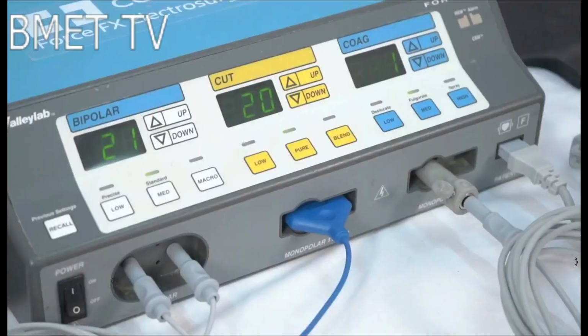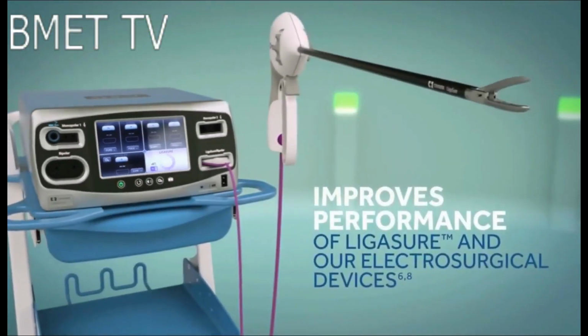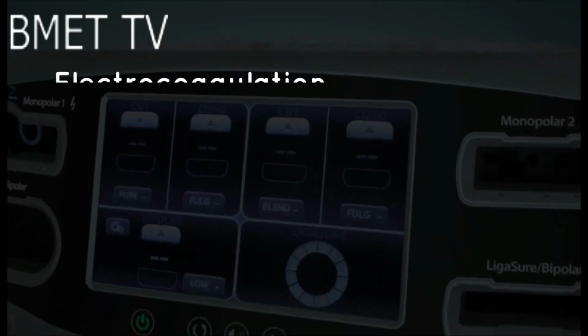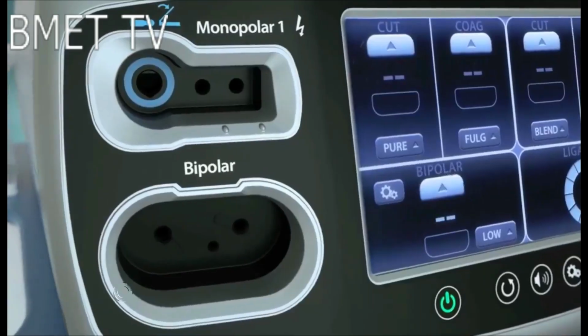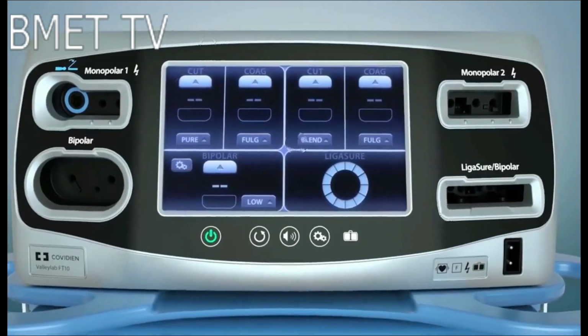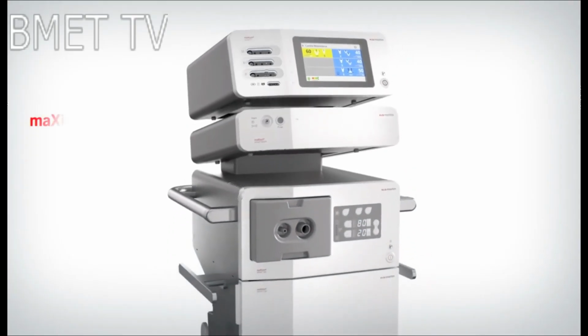Let's look into the types of electrosurgery units. The two types of electrosurgery most commonly used are high-frequency electrosurgery and electrocautery. High-frequency electrosurgery refers to 4 different methods: electrocoagulation, electrodesiccation, electrofulguration, and electrosection. These methods involve high-frequency alternating current, which is converted to heat by resistance as it passes through the tissue. The result of heat buildup within the tissue is thermal tissue damage.